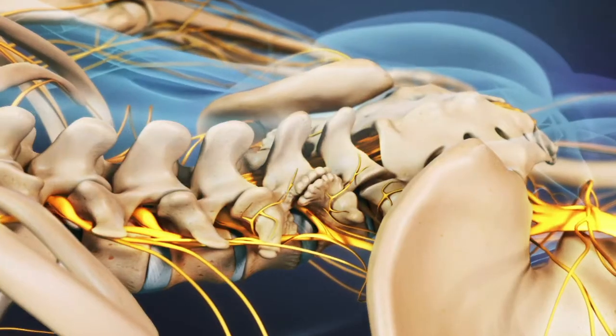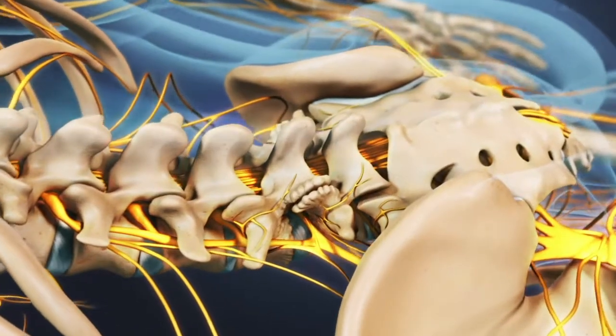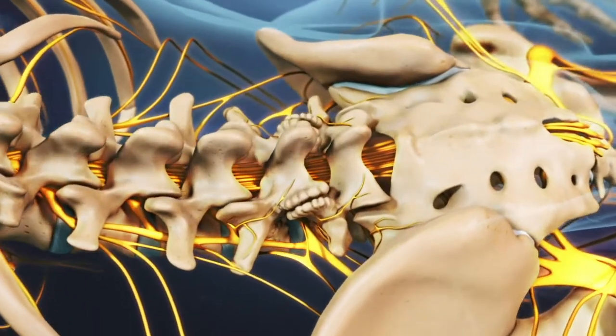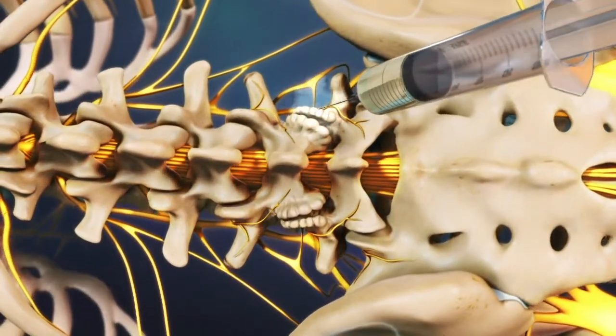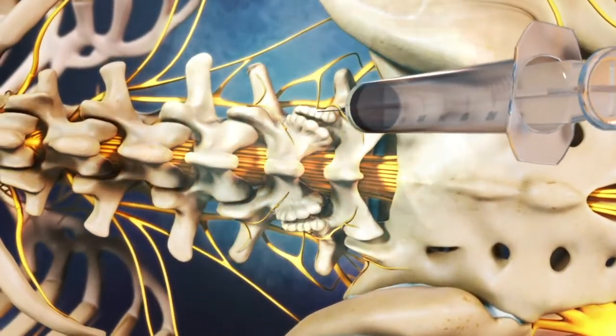A radiofrequency neurotomy, also called radiofrequency ablation, begins with the patient laying face down on a table. The skin and tissue over the procedure site is numbed with an injection of local anesthetic.